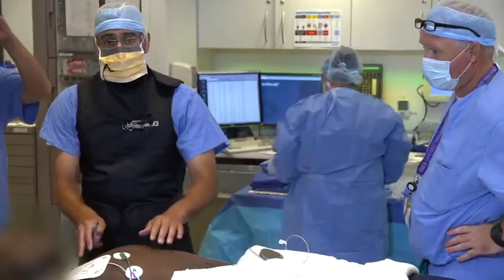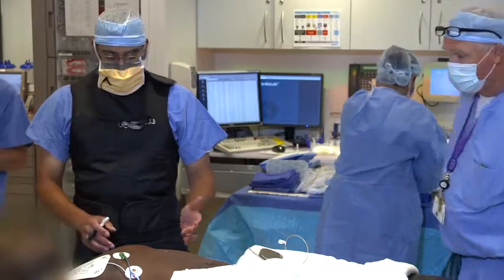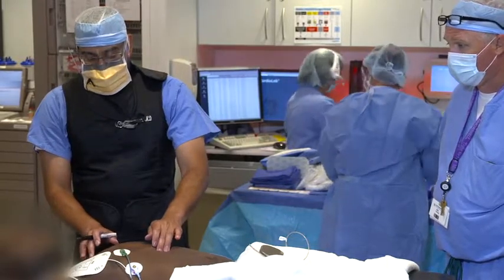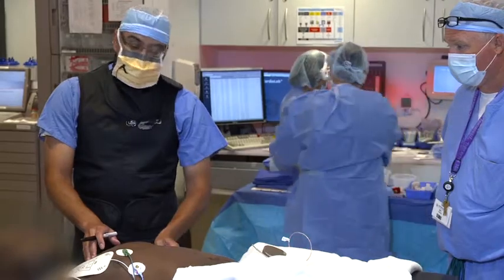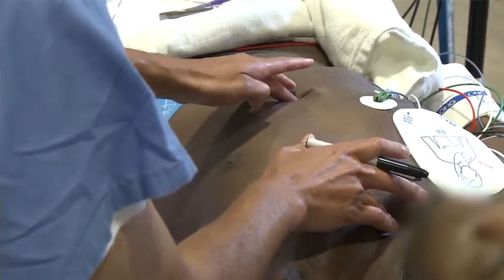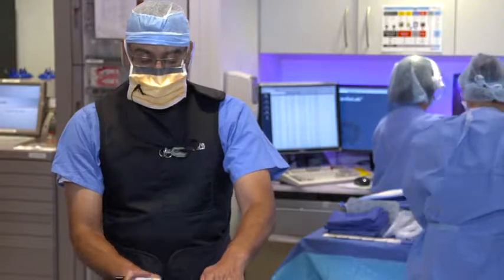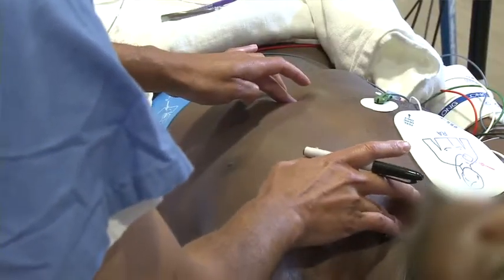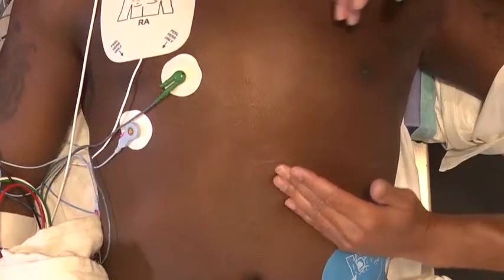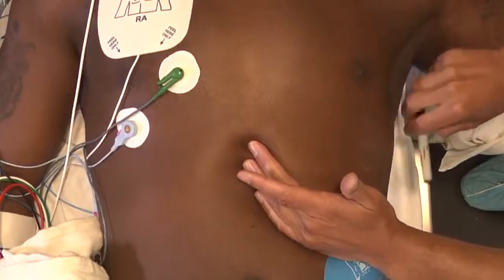We're starting to get an idea of where we want this device to go. Everybody is very different in terms of their body habitus — our patient here is a young fellow with a lot of musculature, so we're going to aim for a good cosmetic result as well as a good functional result. A couple of landmarks: the suprasternal notch here, the xiphoid process is about right here. From the ECG screening, we've determined the best place for this electrode is just to the left of the sternum, maybe one centimeter from the midline. The costal margin comes down over here, and the lead runs straight down, makes a little curve, and enters the device on the side.